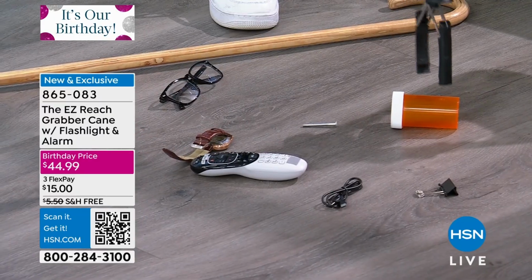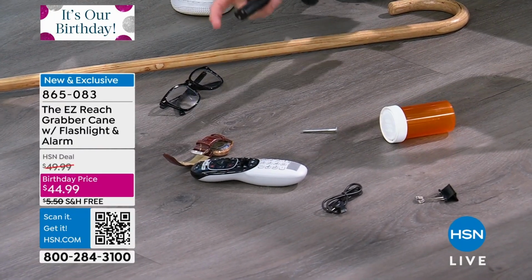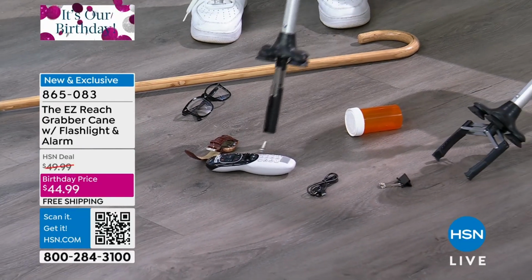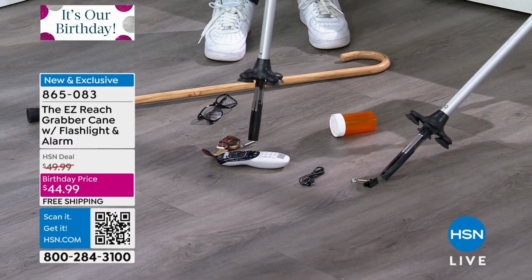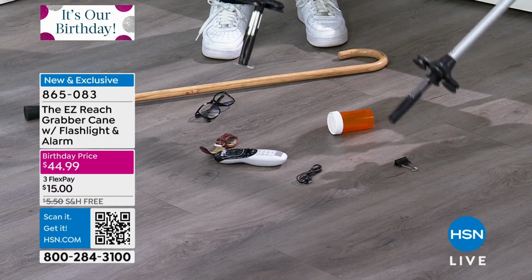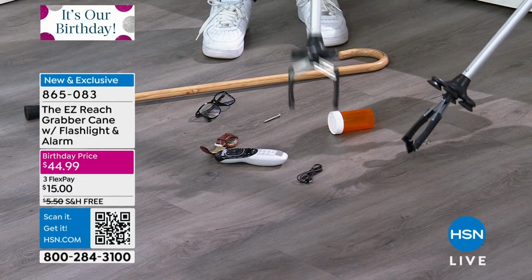I'm gonna try to keep everything in the shot. Maybe it's my pill bottle. But if I close them, at the very tip right here is two little magnets. They're gonna be very hard to see on camera, but I don't even have to grab that little screw. I can just use the magnets that are built right in, and I can pick that screw up right off the ground. See that little screw right there? Yeah. And so I didn't even need to grab it or try to find it.